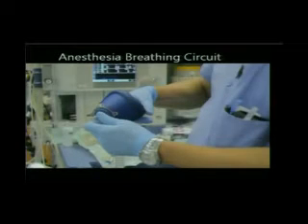There's a mask which you can see there, and if you could just wait for one more moment, Mr. Walgren. There's a mask you can see there that goes on the patient's face, and we learn how to hold the mask so there's a tight seal on the patient's face. And then there is a bag that you squeeze, and that pushes the air into the lungs. So that's coming up here.